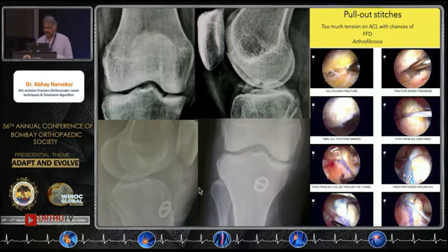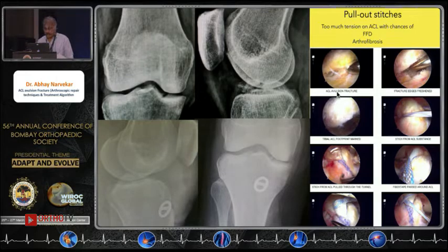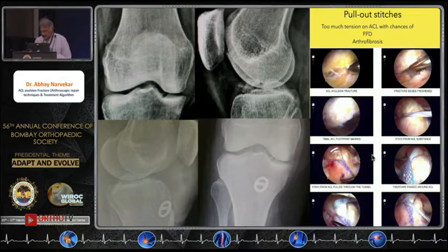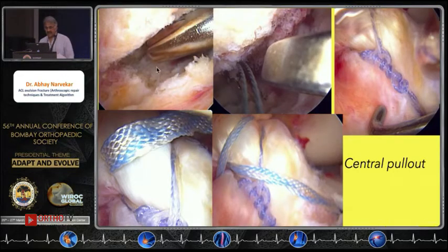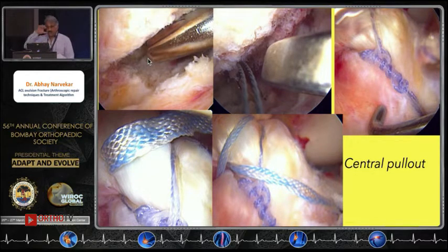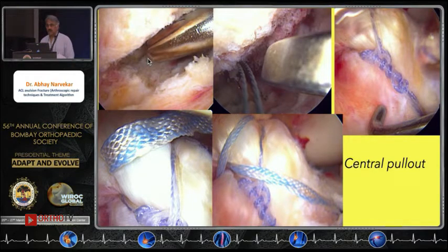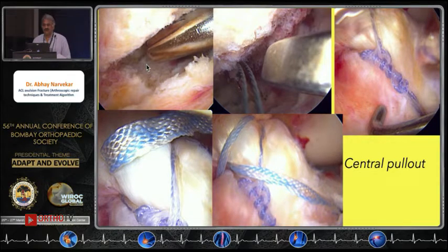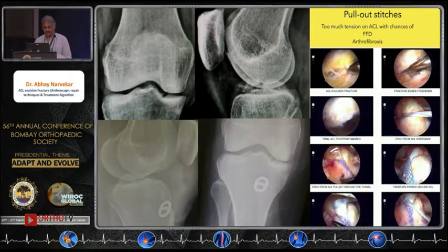If the fracture is comminuted, the basic principles remain the same. Freshen up the area. A key tip for pull-out stitches: take a central portal — pulling from the center and posterior part pushes the anterior portion of the fragment down. Use fiber tape with multiple loops, then place stitches from the ACL base medially and laterally — anteromedially and posterolaterally — to get the entire fragment reduced.